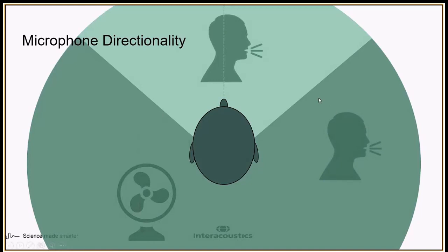But let's say that a speaker then, or another person comes in from the side. Let's say that this is a dinner party where you're sitting at a table. In this scenario, this person sitting over here is less audible than the person sitting at the front. And what modern hearing aids do today, they'll have a couple, if not several, different filters that are constantly scanning in this environment, shaping their polarity towards different speakers.